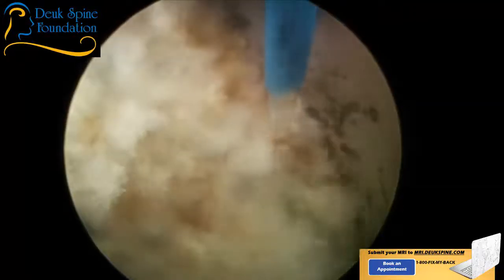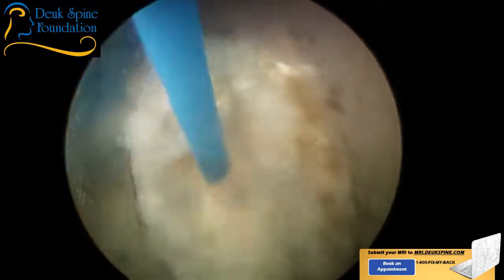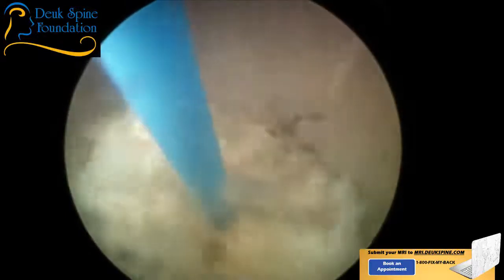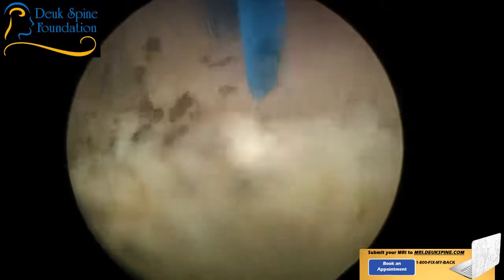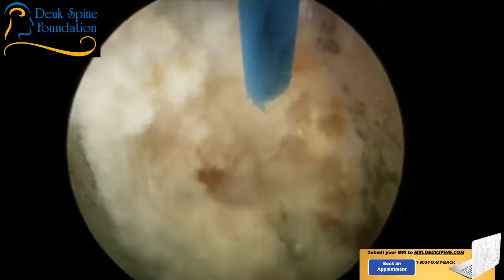All right, Sonny. Any takers? No takers. No takers. The reason you get scar tissue is inflammation. That's the only way to get scar tissue in the human body, through inflammation, the inflammatory healing process. So, this disc is full of scar tissue. I can tell you that. I see it. Time out.